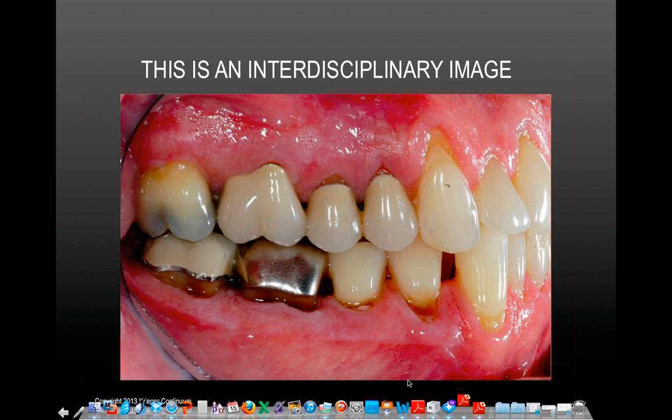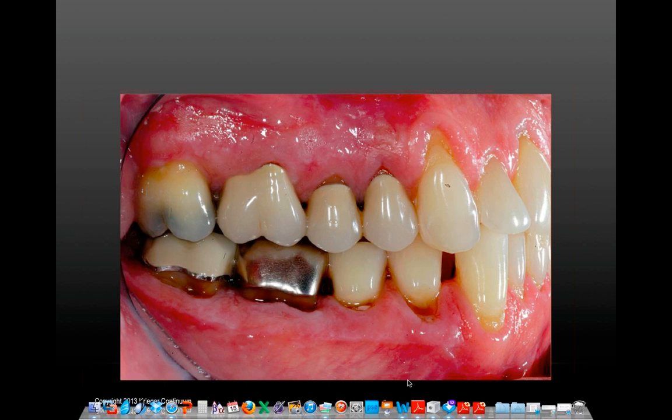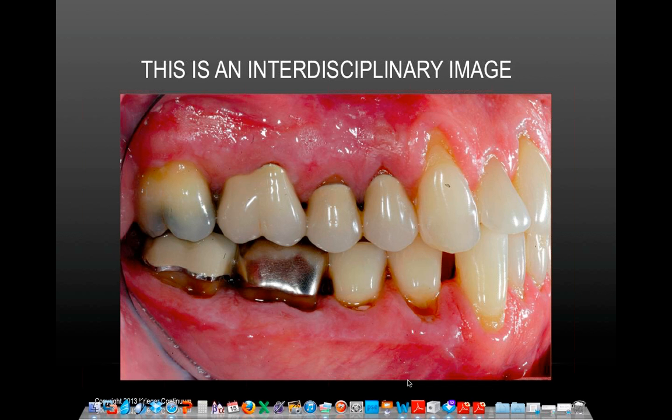But more importantly, let's just take the word sale out of there because some people have a problem talking about money. Do you think that this image gives the patient better or worse informed consent than when we feel so good about showing them this image? So again, if you're a master, these are the images you need to be showing. And if you're not, it's okay. But I want intellectual honesty. I want you to sit back and assess your images.